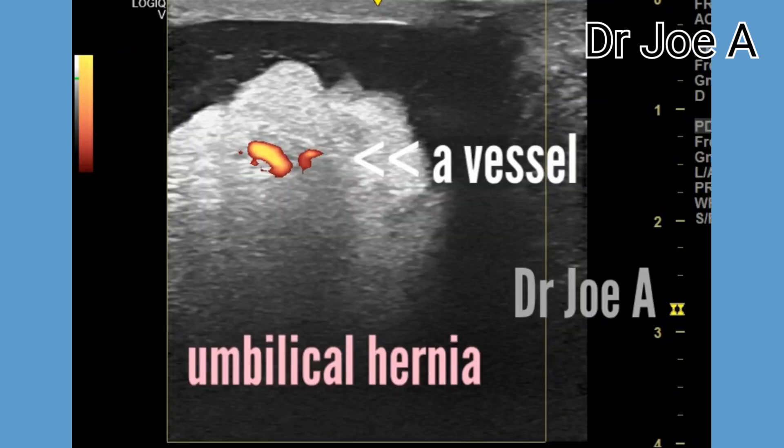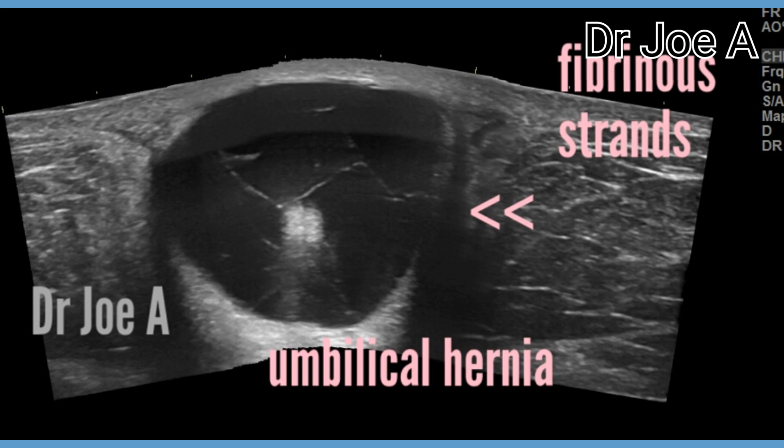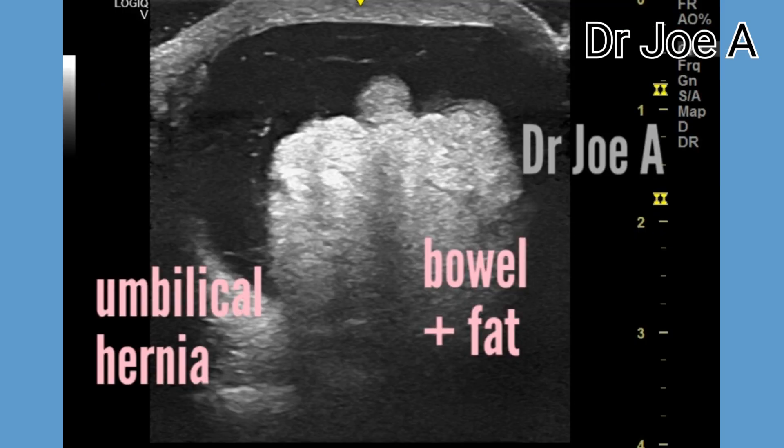In this patient surgery is considered, and the radiologist can provide valuable information about the size and location of the hernia, the extent of the hernial sac and contents, and the thickness of the abdominal wall at the hernial site. This information can help the surgeon plan the appropriate surgical approach for treatment.